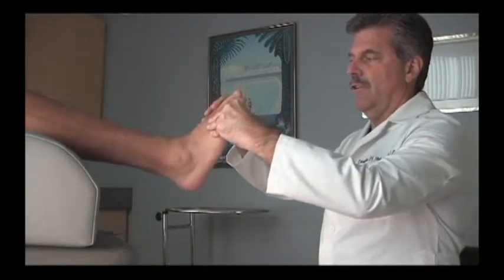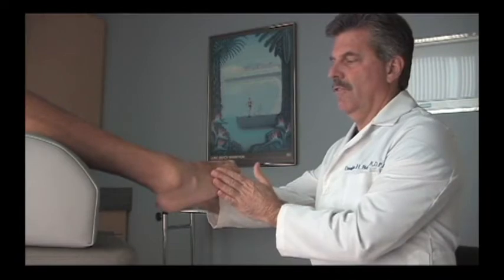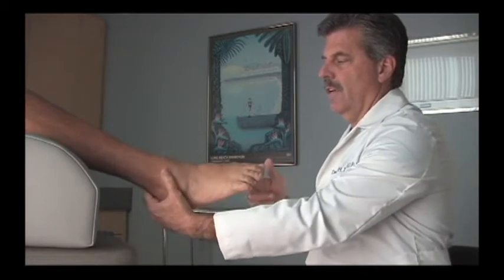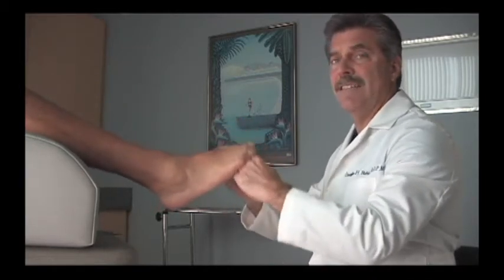Even when asked to dorsiflex the foot, the patient is unable to do so. There is no eversion strength at all as they attempt to push against my hand, and in this case very little inversion strength — just a little. There is fairly good plantar flexion strength, but no spasticity.